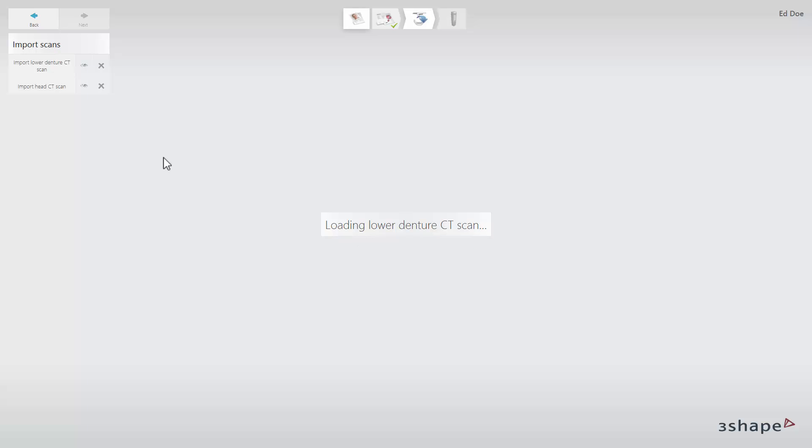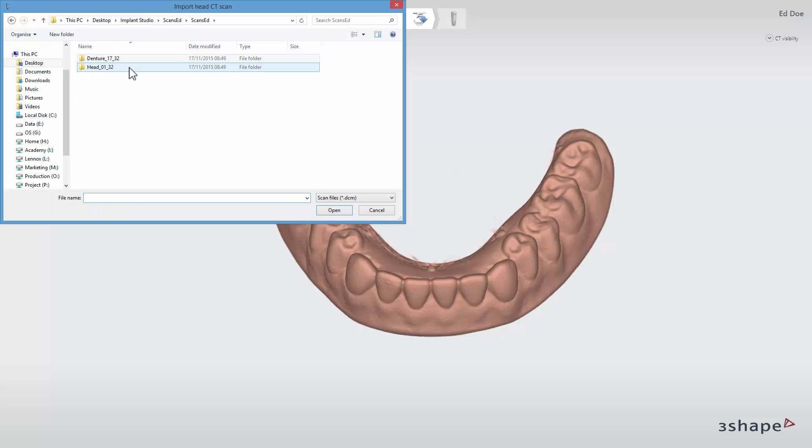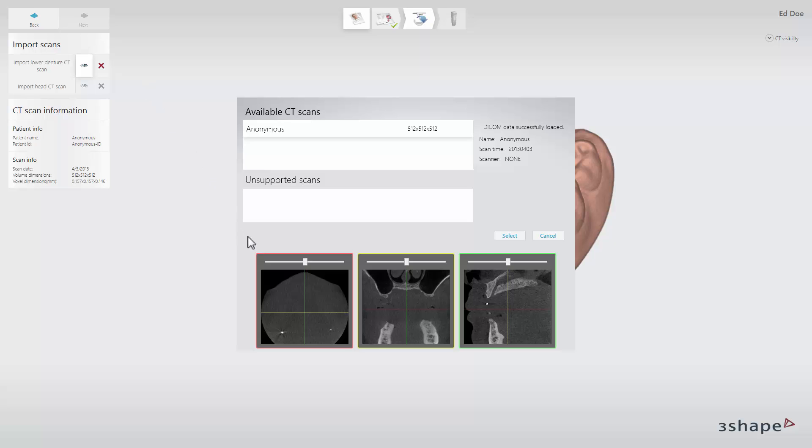The 3D preview of the denture will appear on the screen. To import the head CT scan, click the Import Head CT Scan button. Browse to find the correct file. Preview the scan and click Select to load the scan.